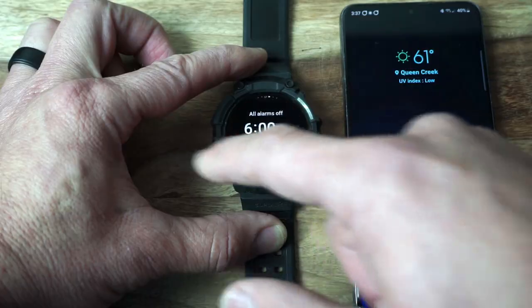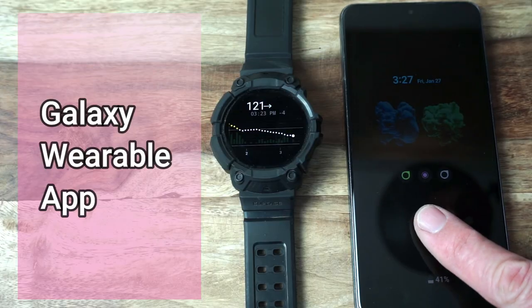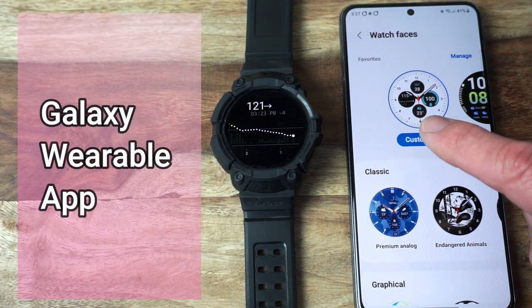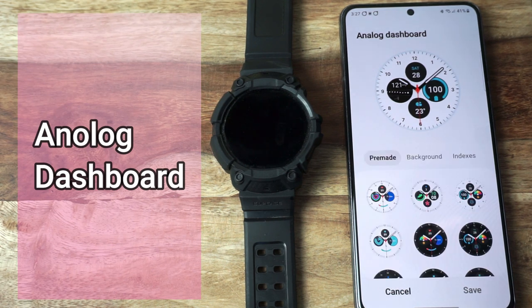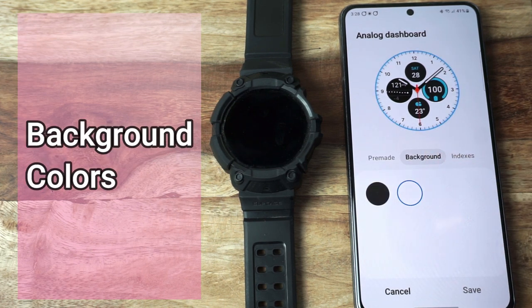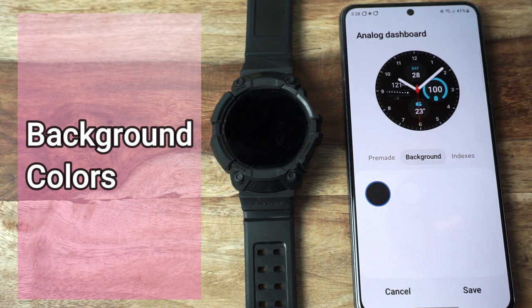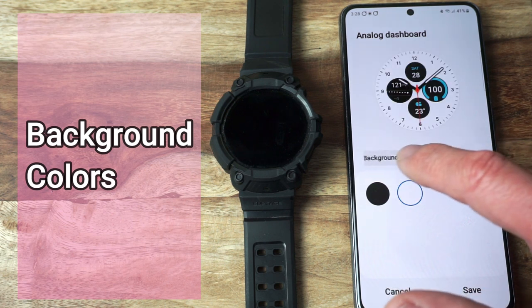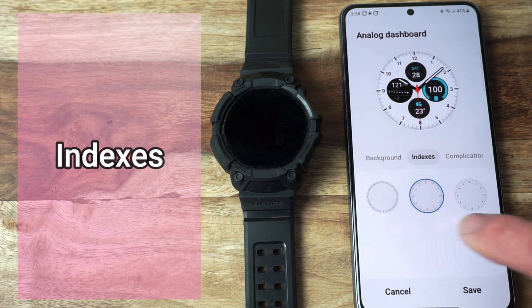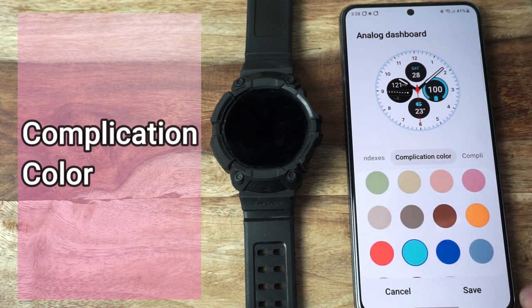So what is the difference between a complication and a tile? The first thing you need to know is that I will be utilizing two different watch face apps to make this work. A watch complication is anything on a watch face other than the time to provide you an added feature. For example, if you go to the Galaxy Wearable app, you will find a section for watch faces. This one is called Analog Dashboard, and it has some really cool customization options. As you can see, there are pre-made faces. You can change background colors, the indexes, complication colors.